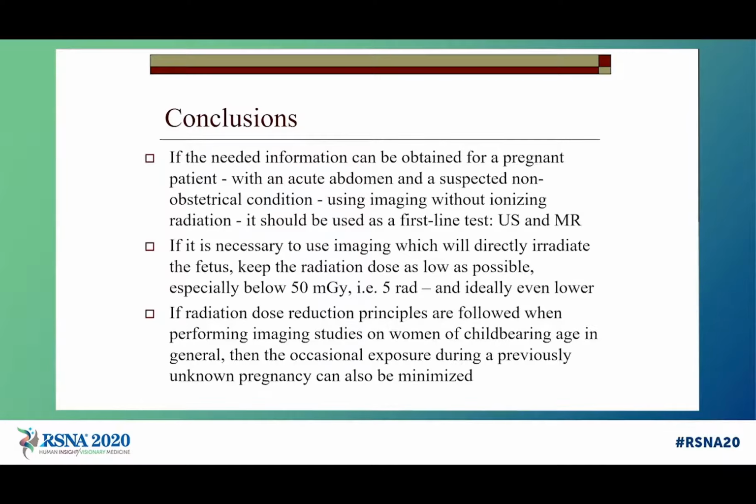Occasionally we may come across a woman who's imaged, who was pregnant, and we don't know it, we didn't test for it, and we could again want to keep the radiation dose low as a norm.